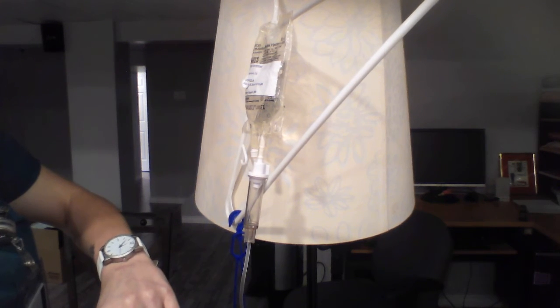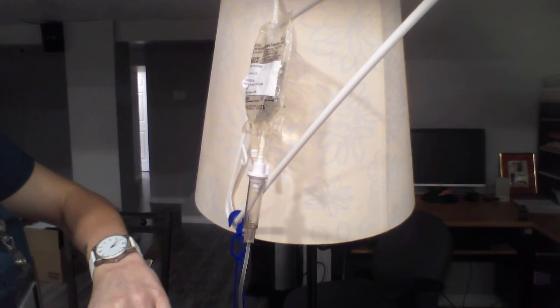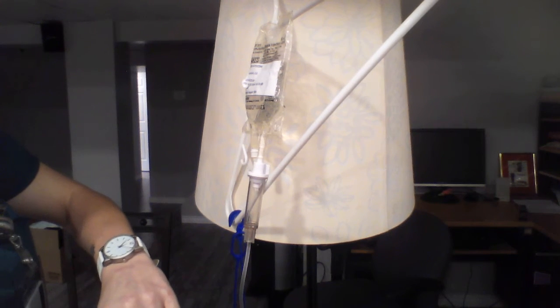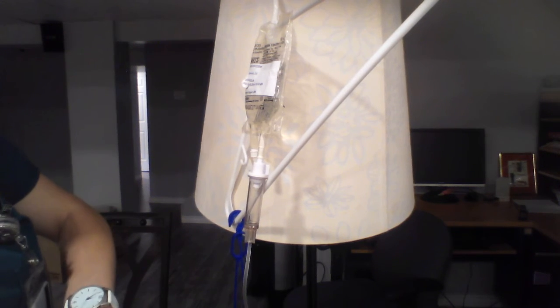Now. It was one drop short, so I'm going to start my minute over.